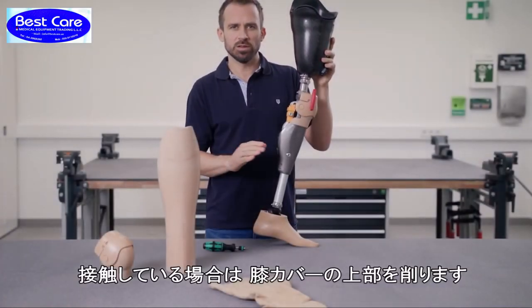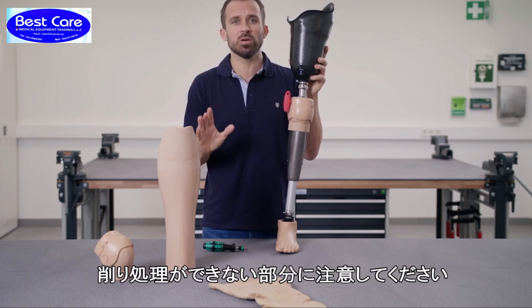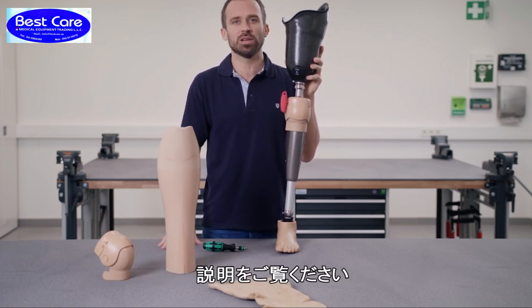If the parts collide, you can sand the upper knee part and the ball attachment. Please remember that there are areas which cannot be modified, as shown in the following illustration.